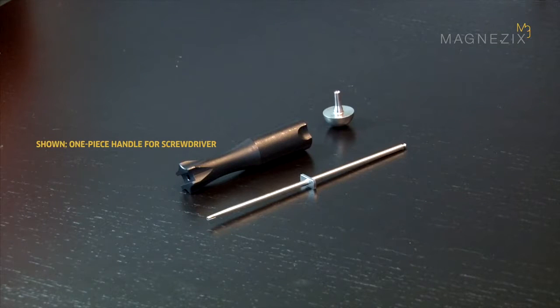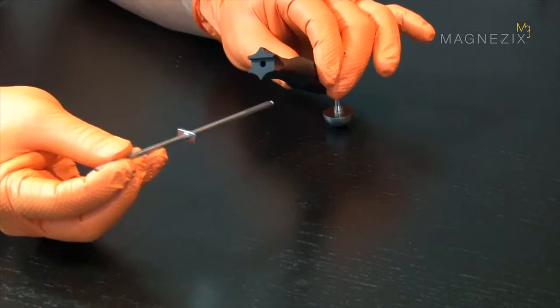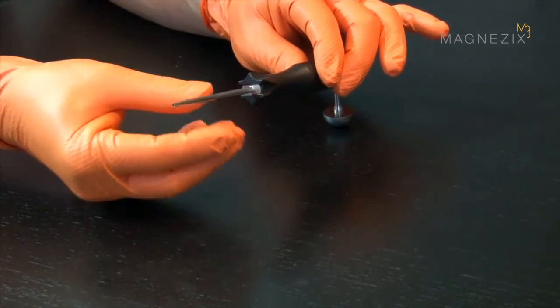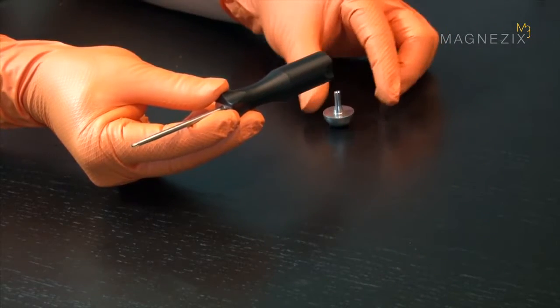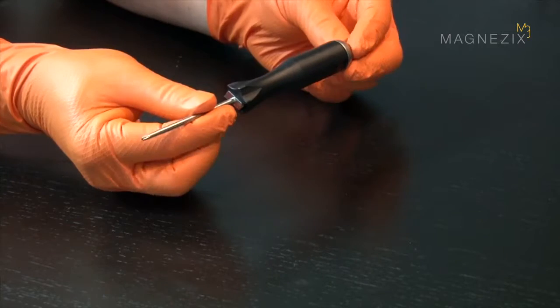Screwdrivers are available with a one-piece or multi-part handle. To assemble the screwdriver, insert the screwdriver blade into the one-piece or multi-part handle. Press the cap at the end of the handle to secure the screwdriver.